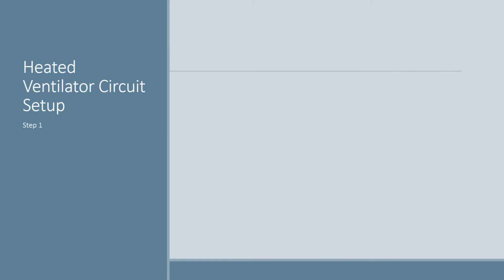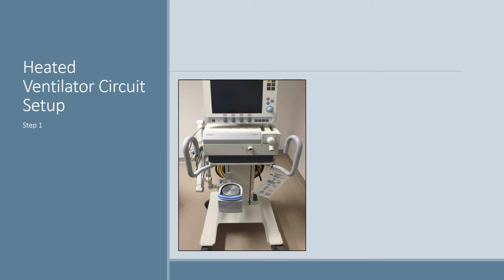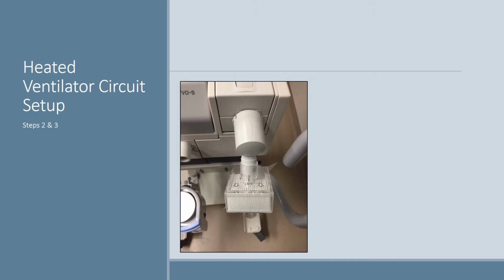Next, I will walk you through the setup of a heated wire ventilator circuit. I'm going to use a laser pointer for most of this to show you what pieces and parts I'm connecting where and when. In step 1, I start with a Servo S that has not been set up. Next, I'll take that expiratory filter and connect it to my expiratory side. You can see here that this expiratory filter clearly states which direction it needs to be placed. This is because the water will collect at the bottom here onto that expiratory side.